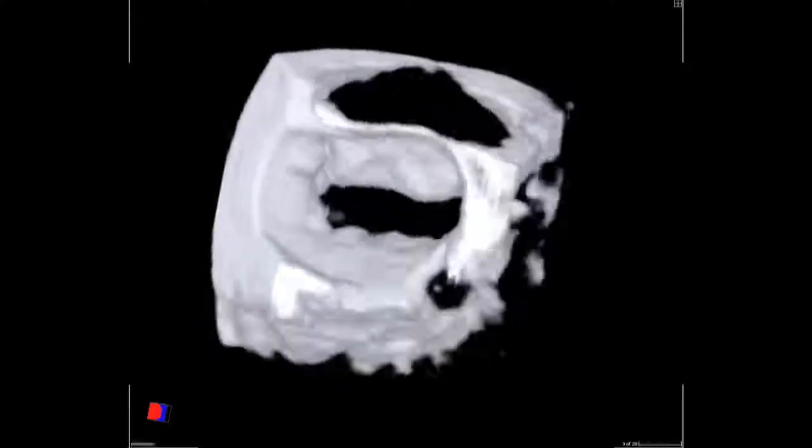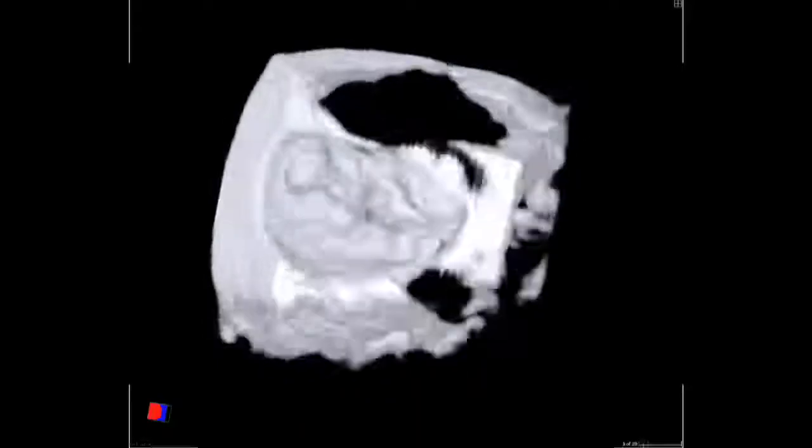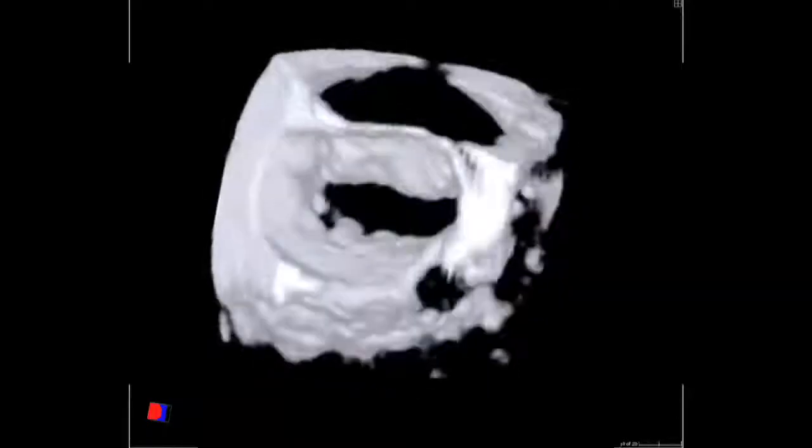This turned out to be a tumor called fibroelastoma that was only able to be visualized when applying three-dimensional technique to echocardiography. This allowed us to decide on the appropriate therapeutic technique to apply to this patient with a surgical resection of this mitral valve fibroelastoma. Again, we can only see this by three-dimensional technology.